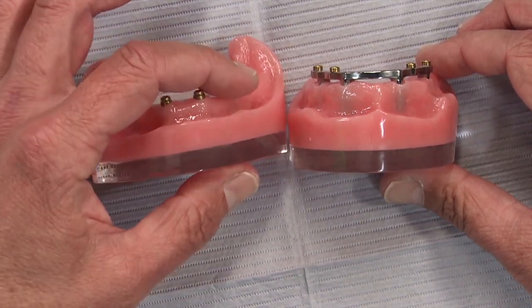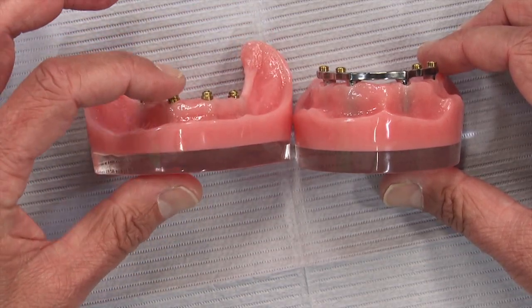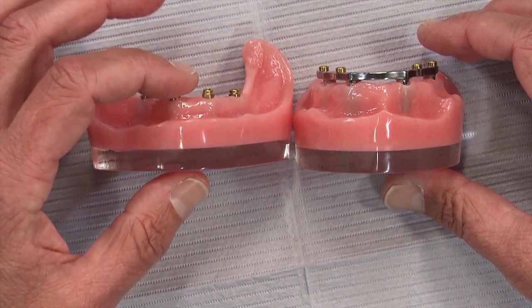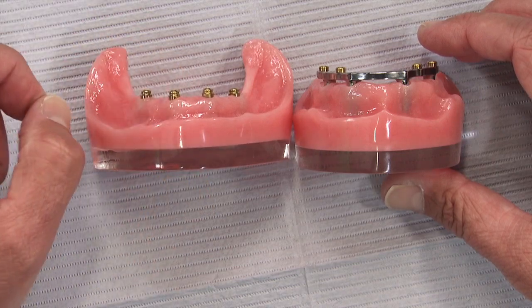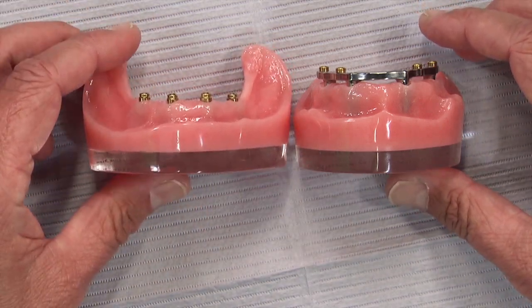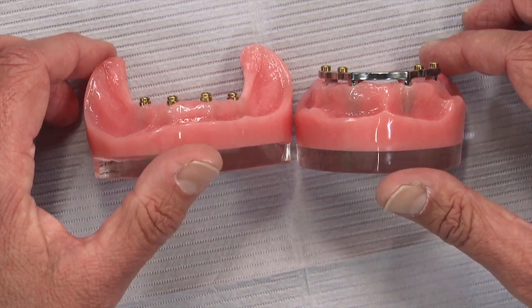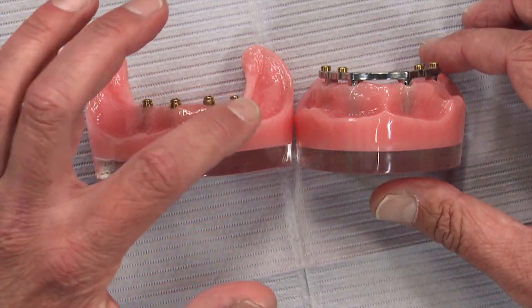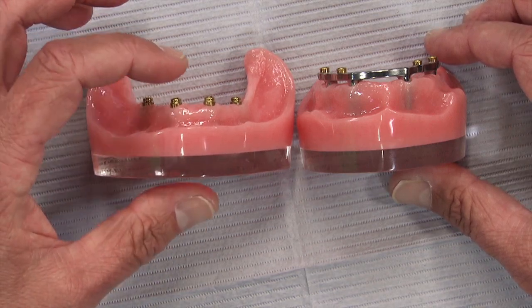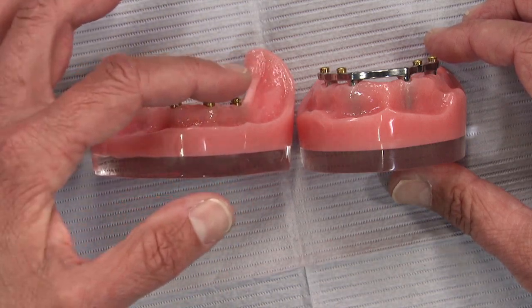Just four locators by themselves are very low profile — we'd like about one millimeter of space between the cap and the gingiva. I've had cases where removing old ball attachments, which were much taller, and replacing them with locator abutments gained a millimeter and a half to two millimeters of space, which can mean the difference between a broken overdenture and one that holds up. The locator attachments come in six different heights to accommodate different implant depths, so you need to let us know what implant system you used and what diameter, and we'll select the appropriate locator attachments to achieve a level plane.